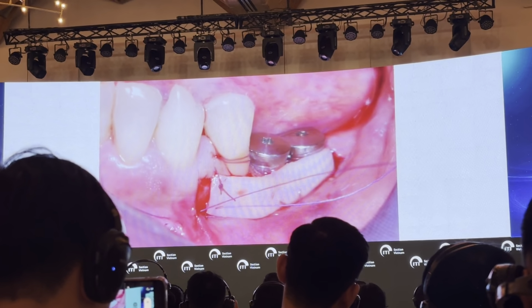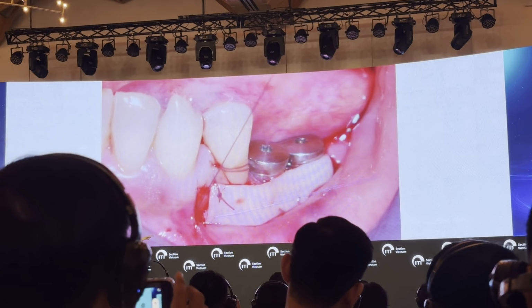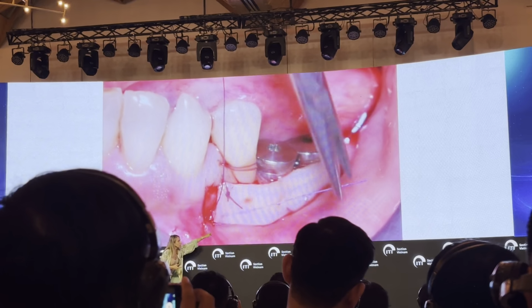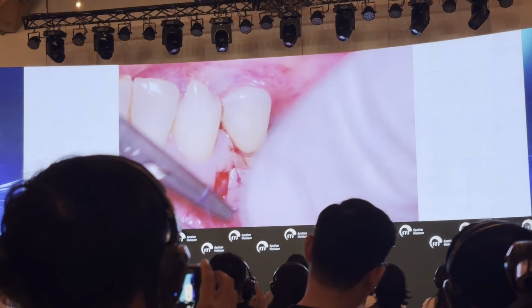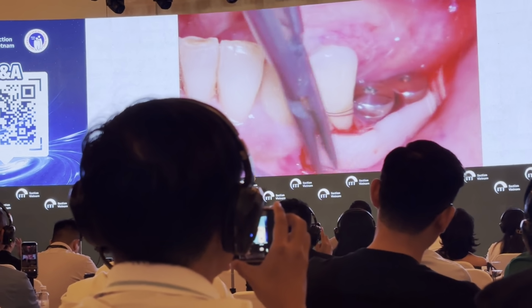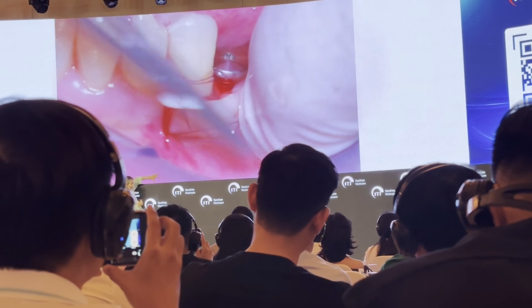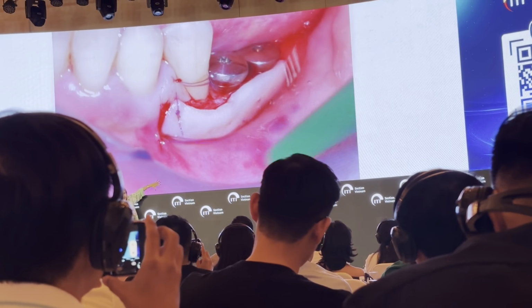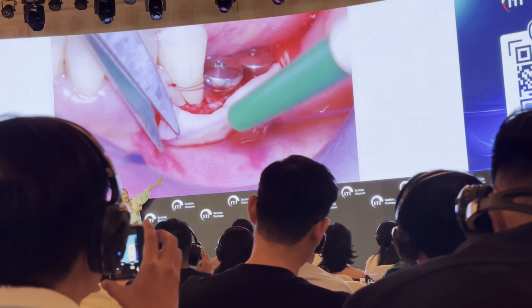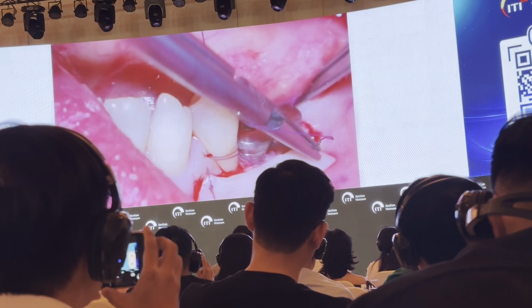The needle comes out externally, and then we come back perforating from external toward the graft without perforating the graft on the way back, but taking a deep periosteal angle. So when I pull the suture, you see that the angle of the graft is stretched toward the peripheral side where there is the periosteal anchorage. So it is stabilized and also stretched to the lateral side.